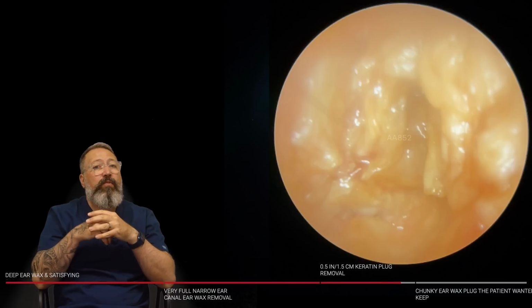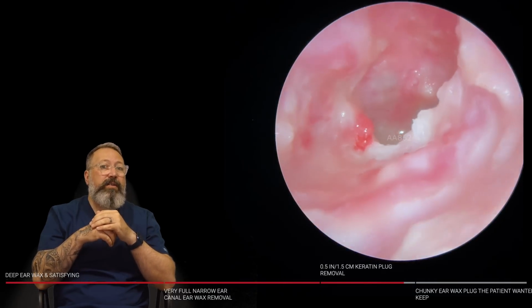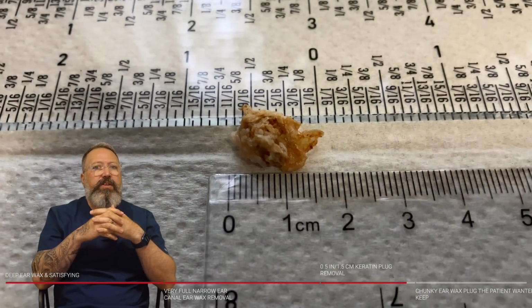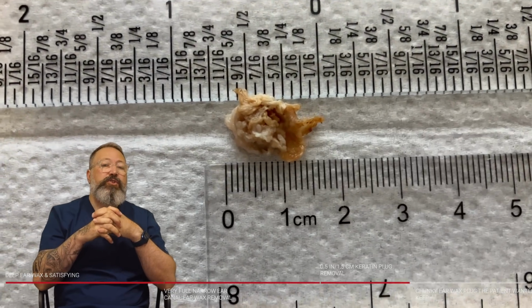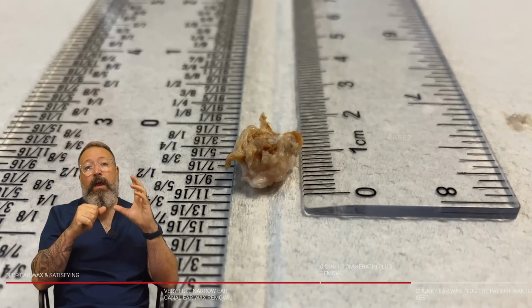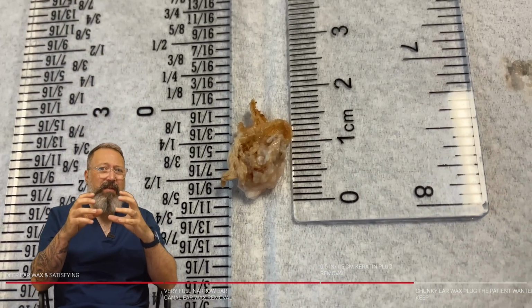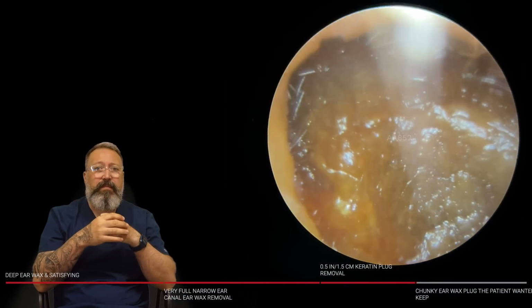But this is what it looked like beforehand. This is what it looks like afterwards. So the patient can hear a lot better and really hearing well. Just over 1.5 centimeters, just over half an inch there, or 5/8 of an inch if you want to be super duper precise. But patient feeling so much better having got that out. You can see just the thickness of that plug, and that is completely just skin, solid skin.